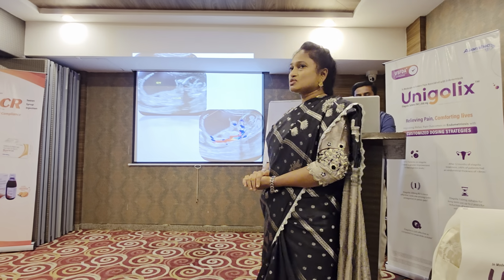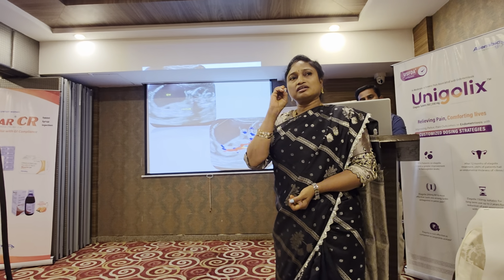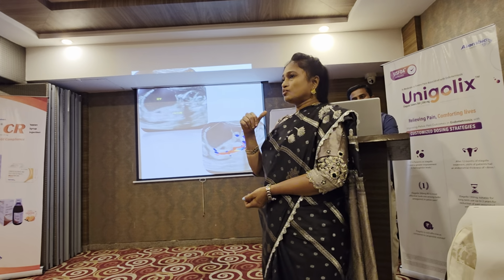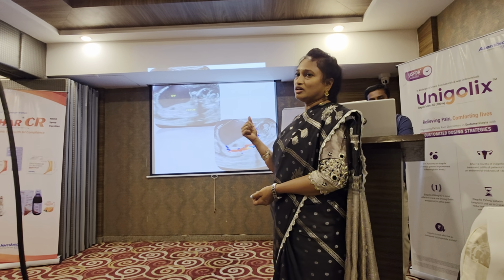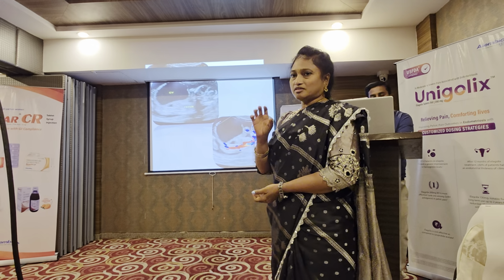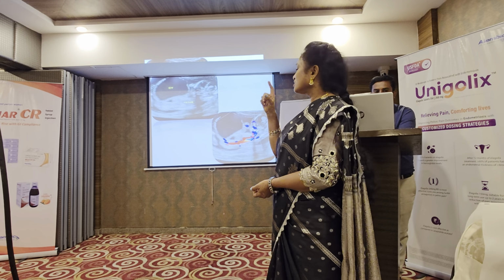Next one. This will lead to any kidney problem. It will either lead to oligohydramnios or polyhydramnios. Usually oligohydramnios is because that kidney is not functioning or there is an obstruction.